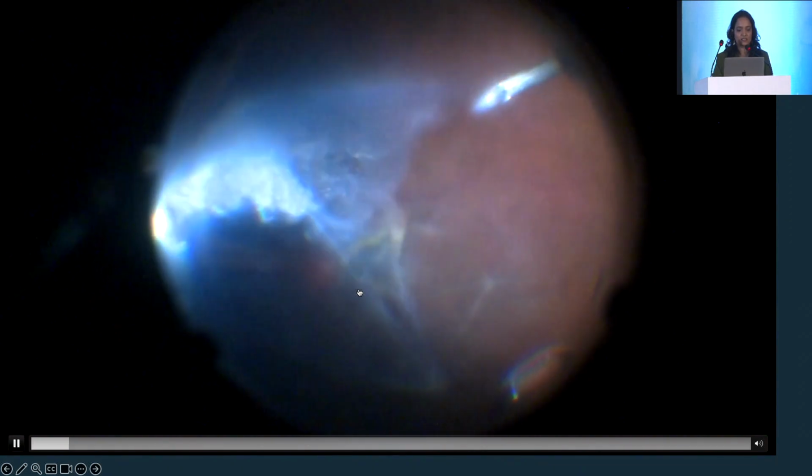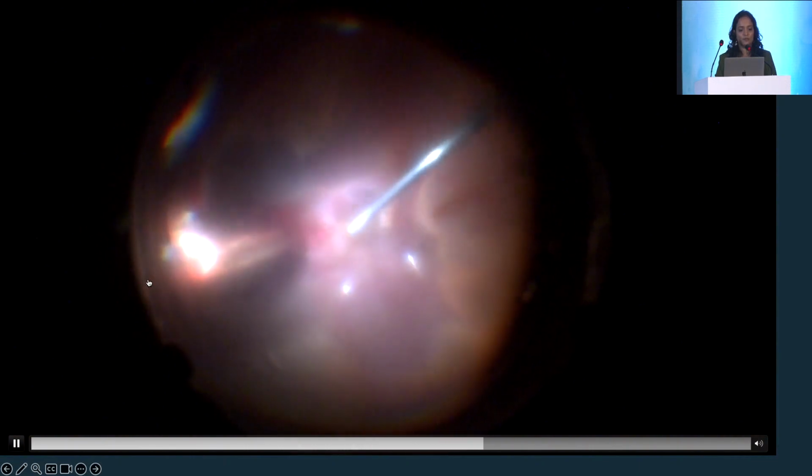Now this was the first surgery that we do. We retina surgeons usually talk in terms of first surgery, second surgery, third surgery, because we know we'll go in again. So yeah, that apart. Now you can see that there is a lot of vitreous haze and opacities which we took care of, and then there was this nasal incarceration of the retina. Here you can see that there are retinal folds nasally, and this one here. So I released it from its incarceration, did a thorough base shaving, went in, saw there were chronic folds at the macula, and I managed to attach this retina.